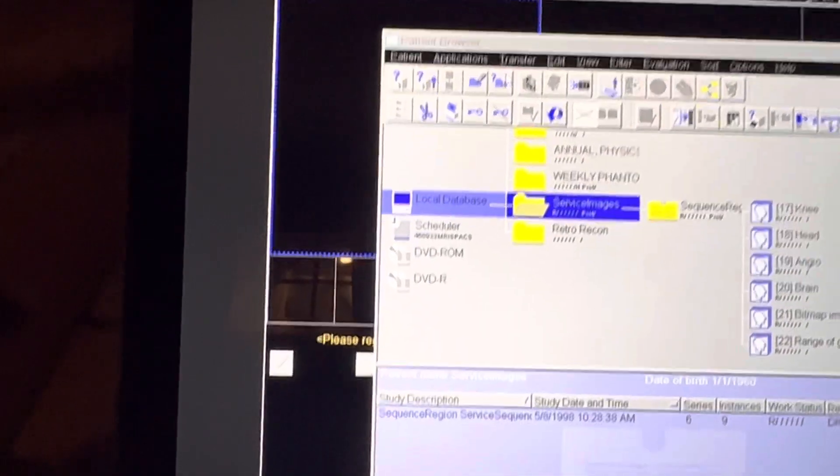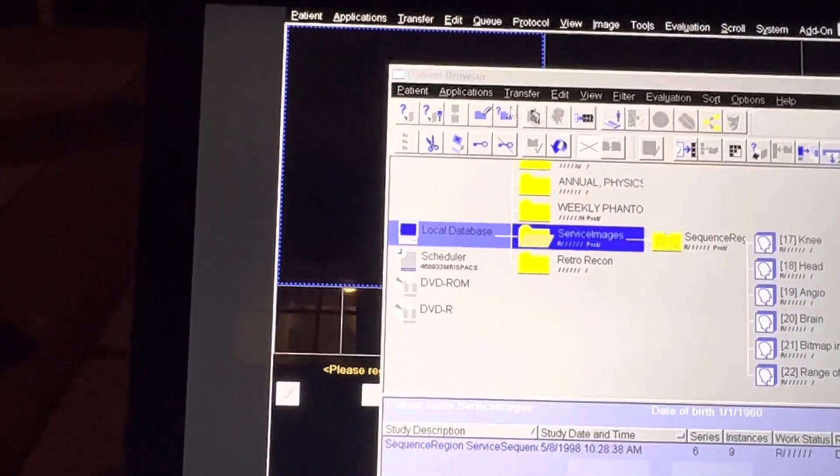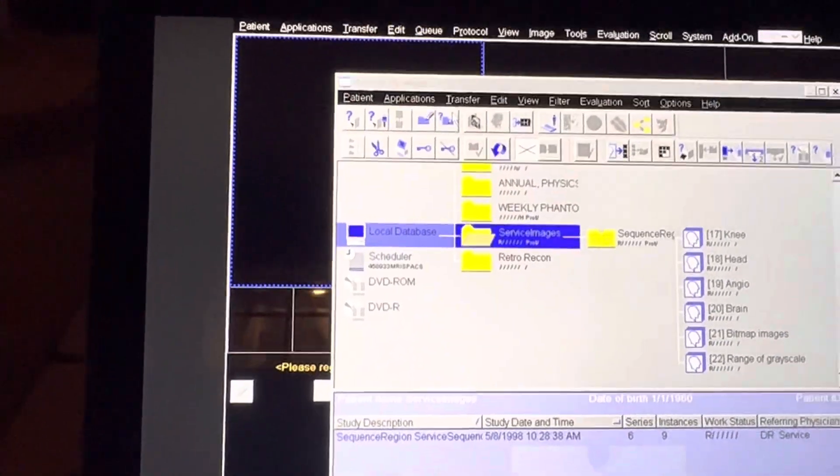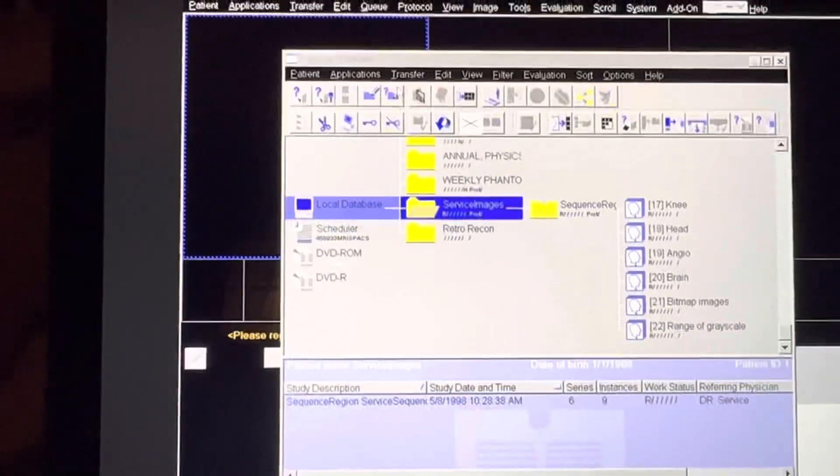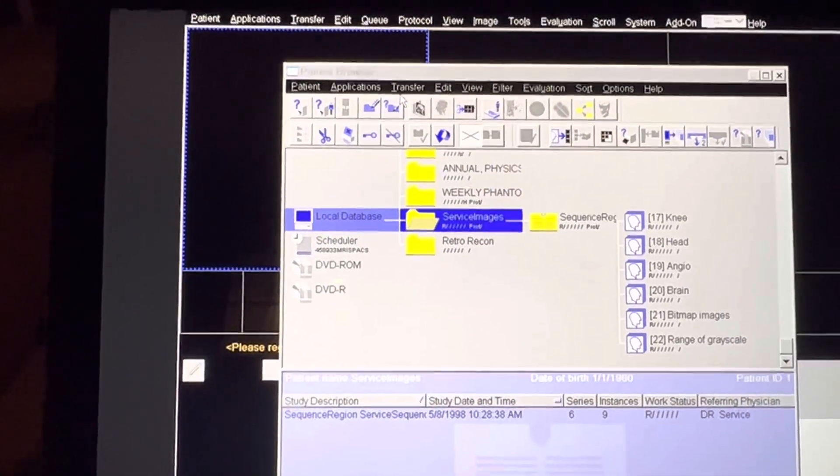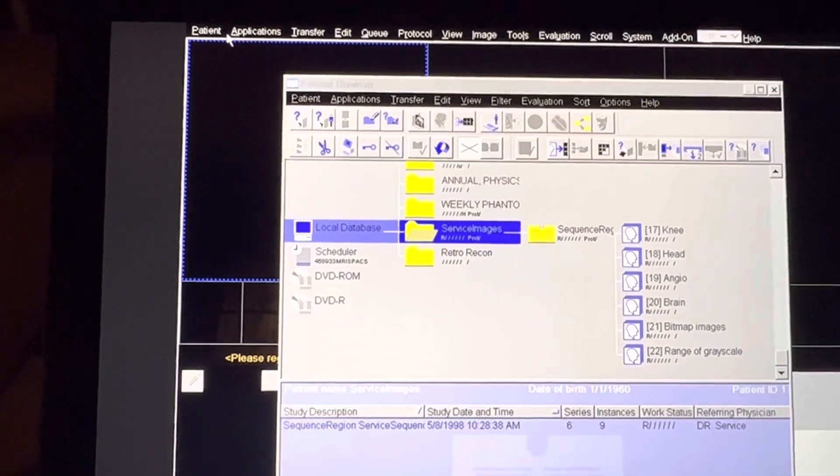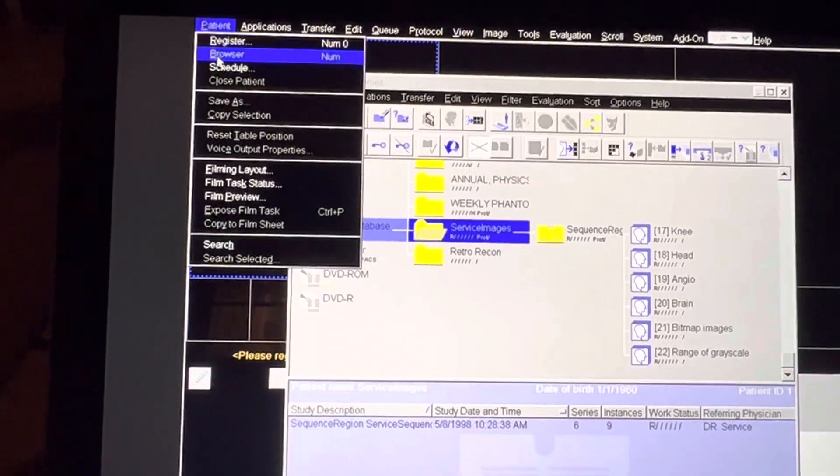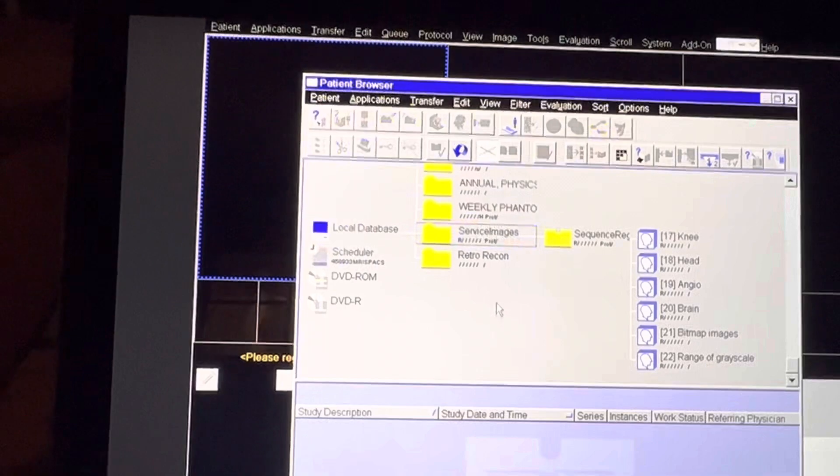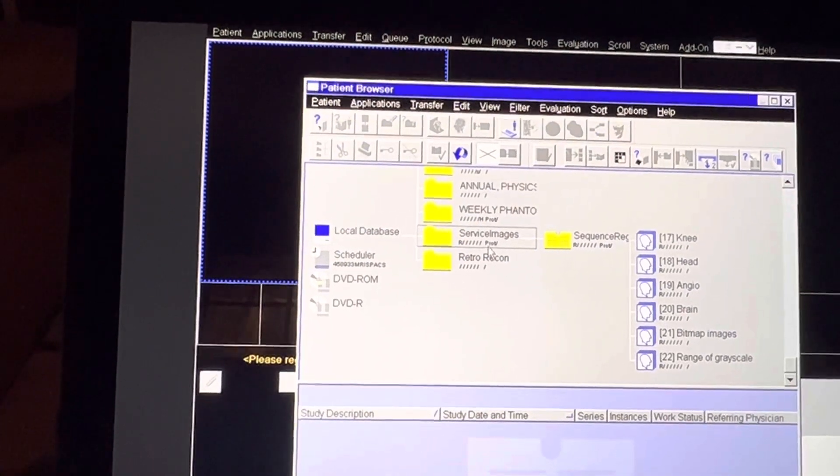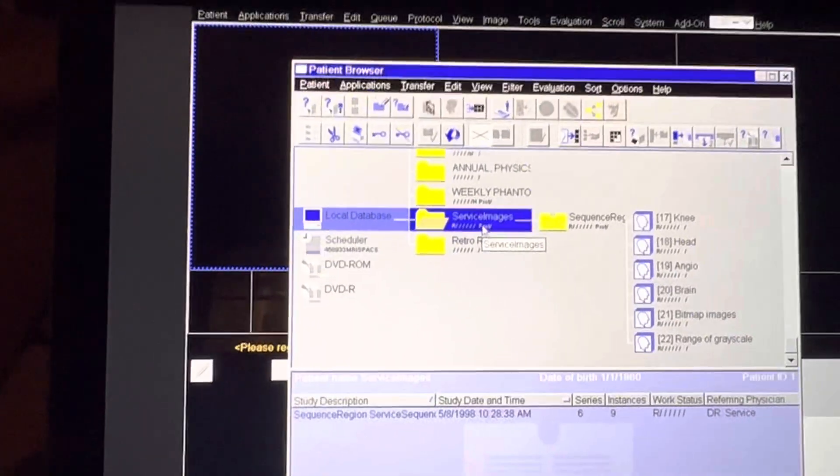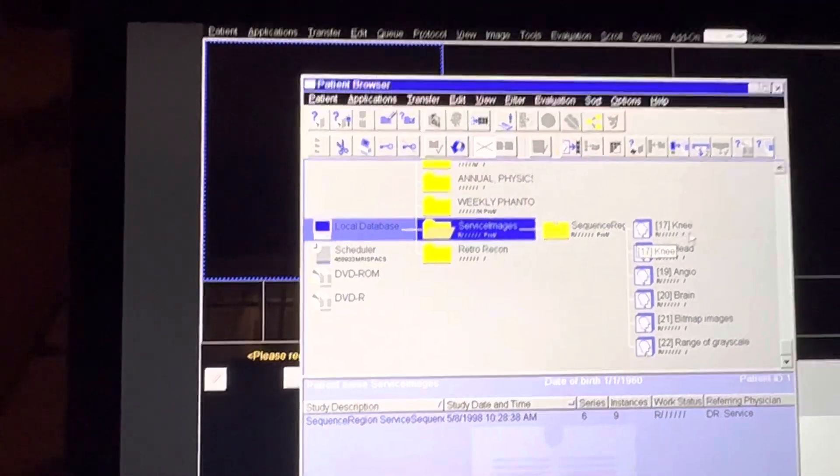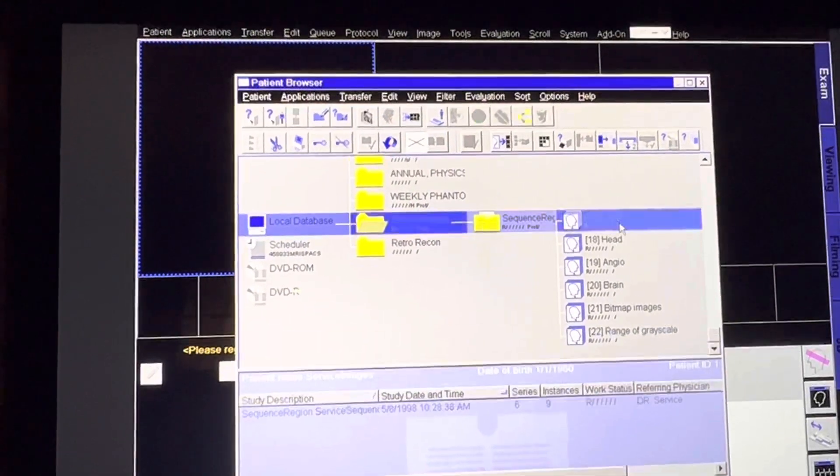Alright, so if you would like to know how to load the entire patient into the viewing, I'm doing this on my cell phone via a TeamViewer app. So you click on Patient Browser, right? That'll open up this page. This just happens to be the service images tab.